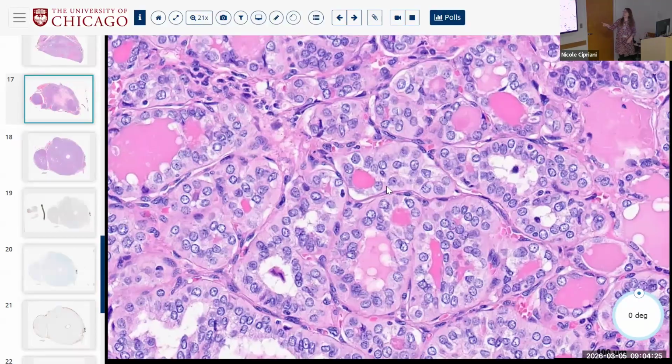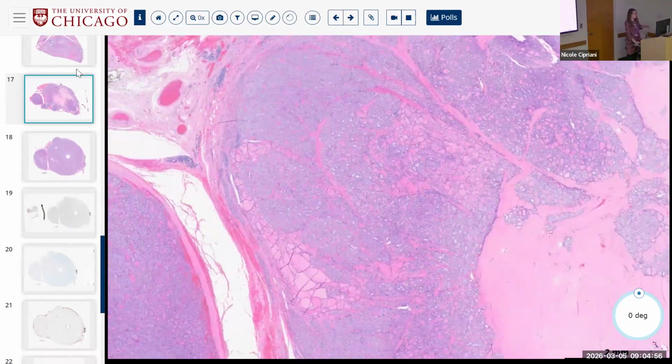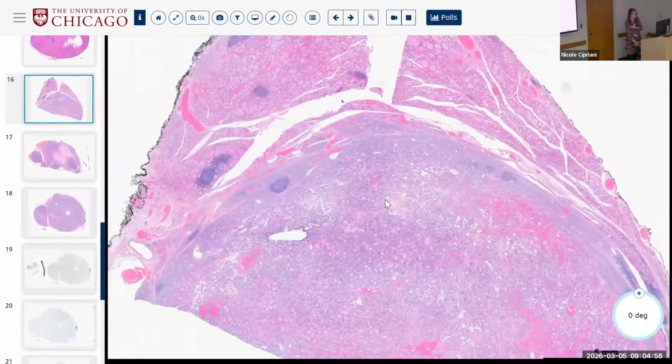And the nuclei are not overwhelmingly papillary. They're subtly shifted, with subtle nuclear clearing, but usually no good pseudo-inclusions. They do have psammoma bodies, right? So they have this hybrid morphology between follicular patterned growth and minimally atypical nuclei, but usually widely invasive, and they may have psammoma bodies. The other type, this is another NTRK fusion tumor.